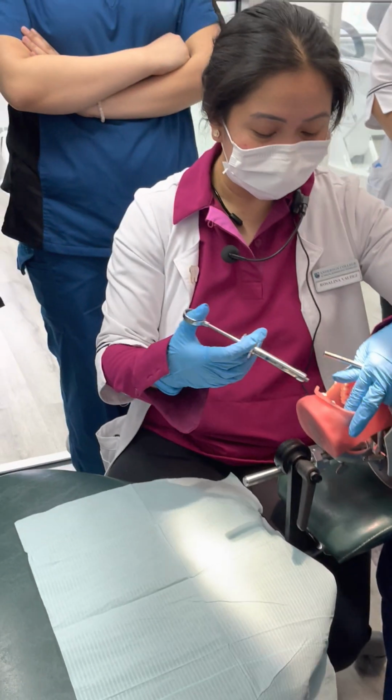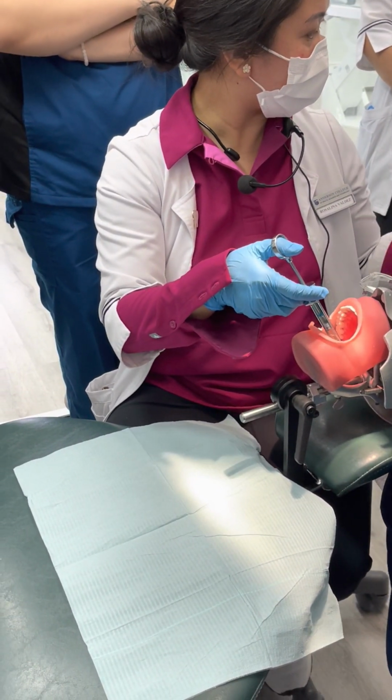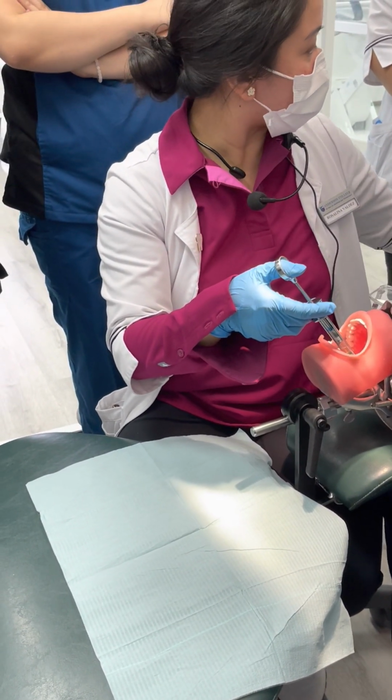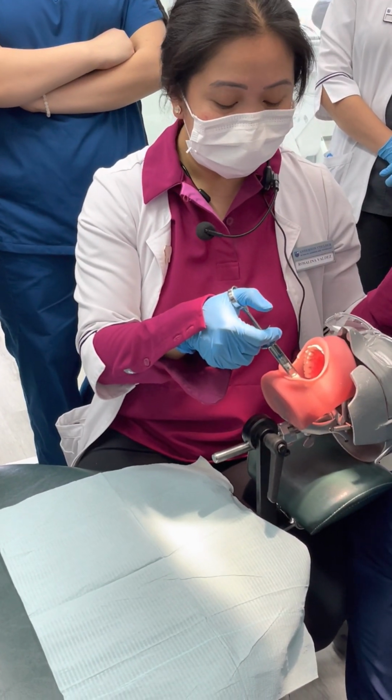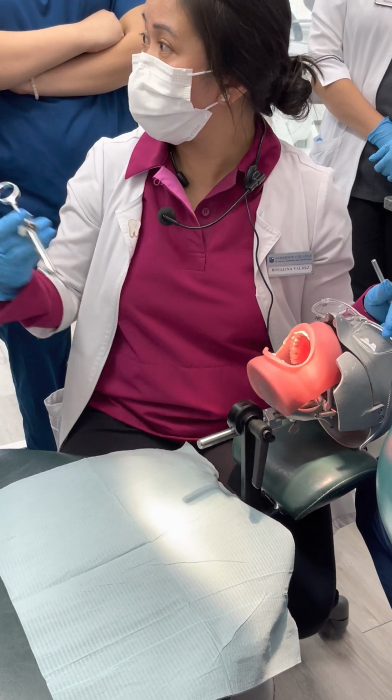Just remove the whole thing. And then put it in the needle cap holder. Just cap it back because it's loose. Okay. So once this is done, can you turn on the compressor?